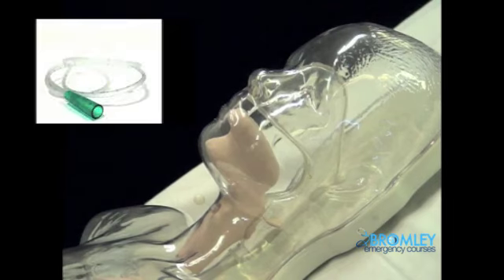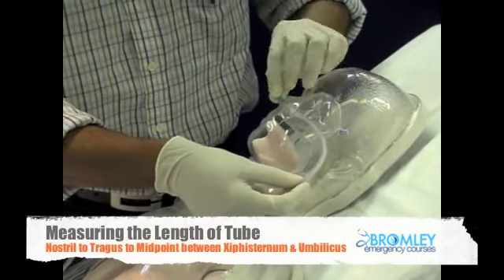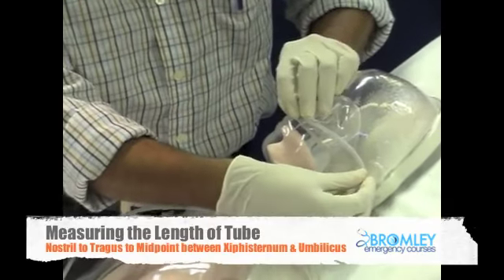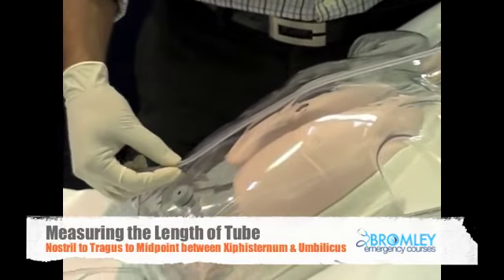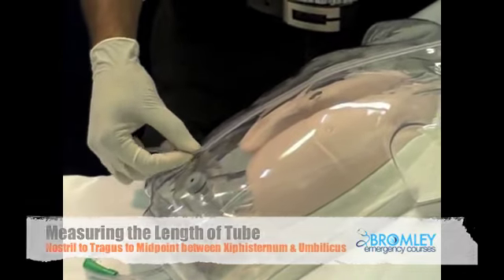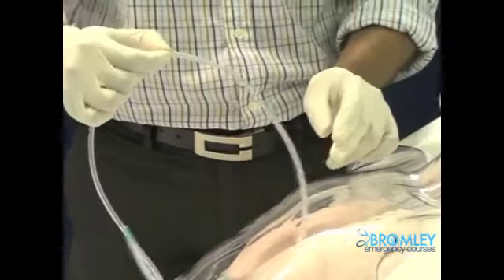This is a demonstration of NG tube insertion. Ideally, we want the NG tube to be kept in the fridge or freezer for a while so that it's quite stiff, so that it can pass easily. I'm going to measure the NG tube length from the tip of the nose, to the tragus, all the way down to midway between the xiphisternum and the umbilicus. So make a marking there, and that's how much length of the tube should be going into the stomach.